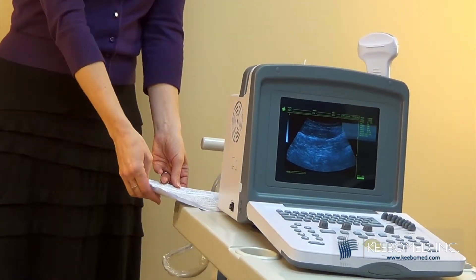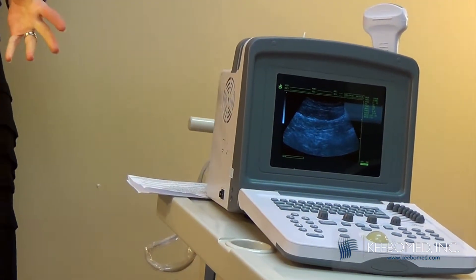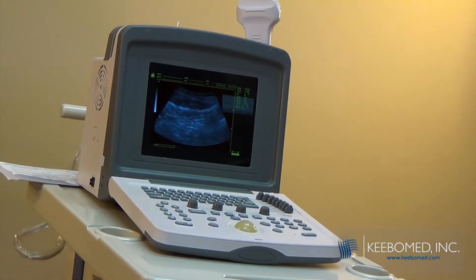Now we've improved it. It now has an LCD screen, giving it a better image, and it's also more lightweight. It weighs in at 12 pounds, down from the original 20 pounds.